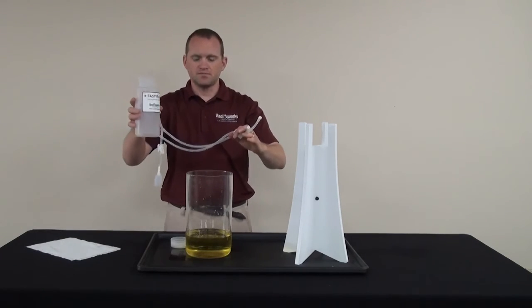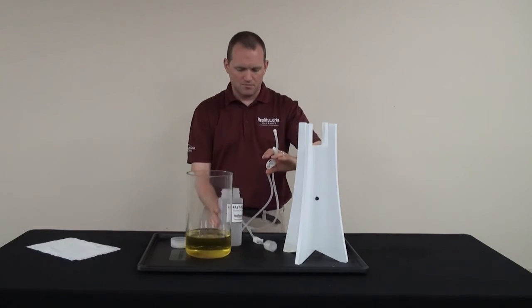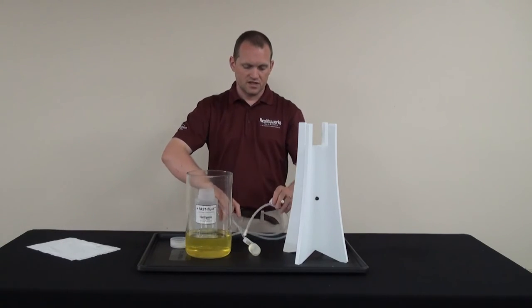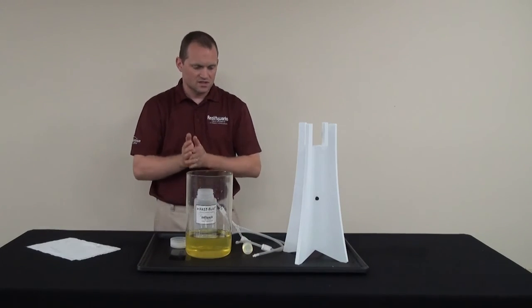wipe it clean with a towel, and set out to dry, making sure that the clamps remain open to allow the excess liquid that's trapped inside the tubes to dry out.